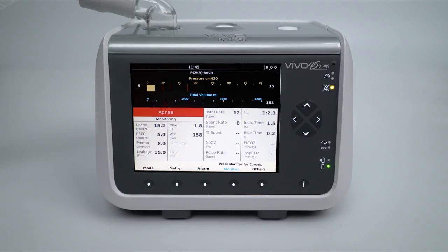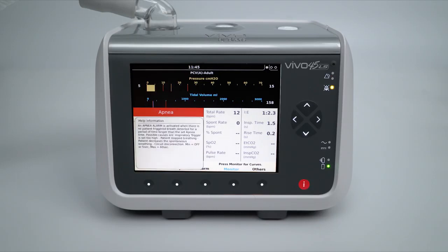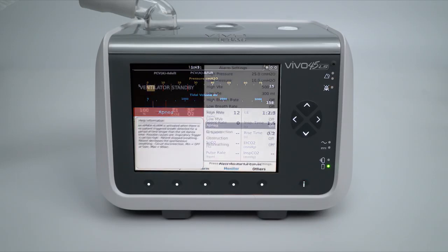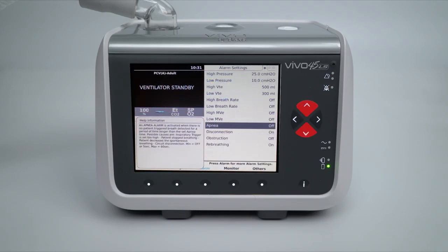When the Vivo 45 LS is displaying an active alarm condition, the user can gain additional information of the activated alarm by simply pressing the information button. When the Vivo 45 LS is not in an active alarm condition, the user can use the up and down navigation buttons to highlight an alarm and then press the information button. The displayed information includes a definition of the alarm, possible causes of the alarm, and the minimum and maximum trigger settings for the alarm.